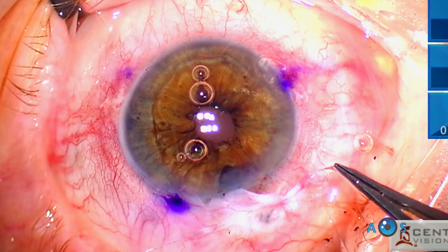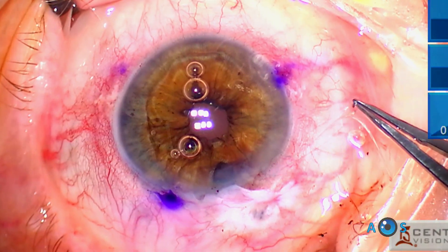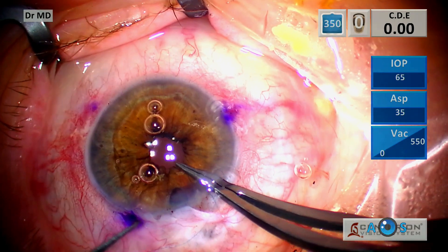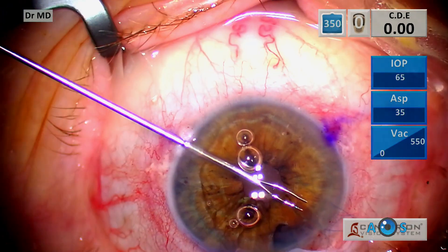A second square knot is given with two throws. Again, to secure the knot, the thread is placed inside the anterior chamber and the distal thread is pulled through an opposite corneal side port.